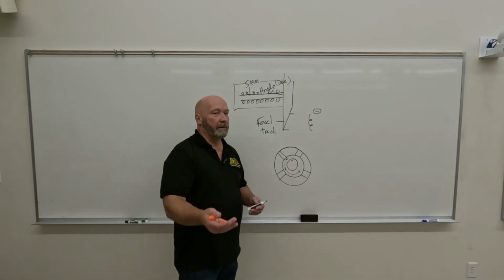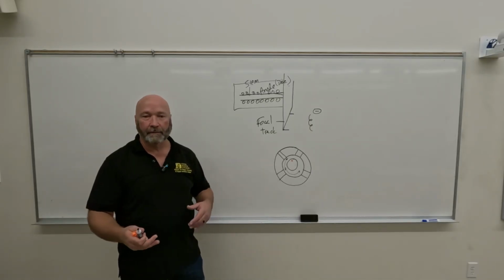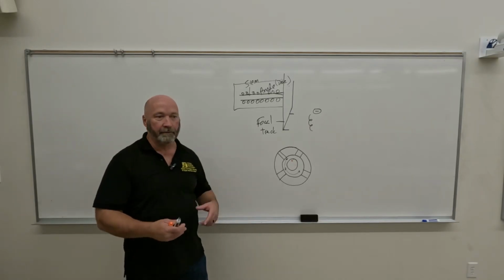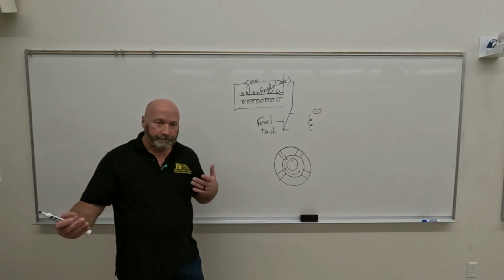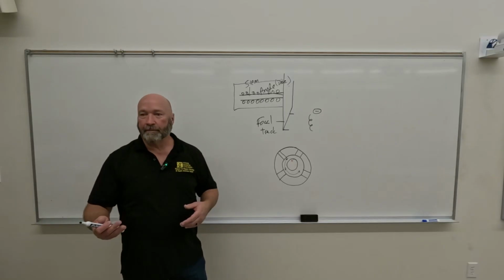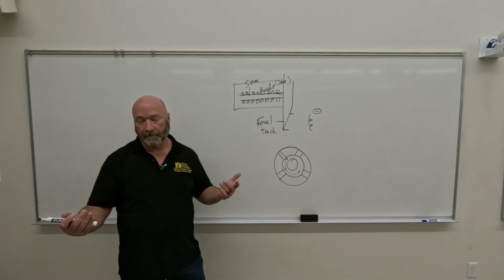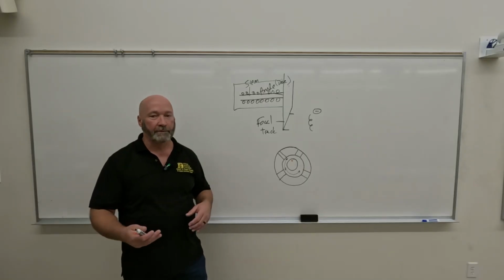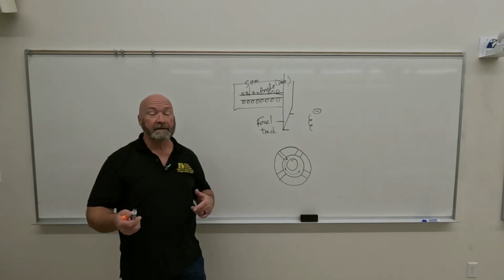So what you're going to look for in test questions on the induction motor is that there are electromagnets that fire in sequence to accelerate the anode from 0 up to, I usually say 3,000 RPM. Bushong is a little bit more specific, probably more accurate, 3,400 RPM. So it goes from 0 to 3,400 RPM. And the commonality here that we both agree on is about a second.